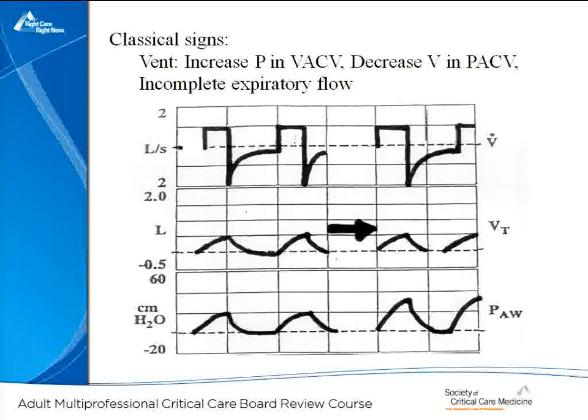So this suggests that air trapping is building up, and that's very common in patients with COPD, particularly ones who are on a fairly high minute ventilation, as this lady is. We're blowing her PCO2 down to 38, for heaven's sake. She may not have seen that for a while. And as you can see, over time, her pressure builds up. So the classic signs of air trapping building up in volume assist control ventilation.